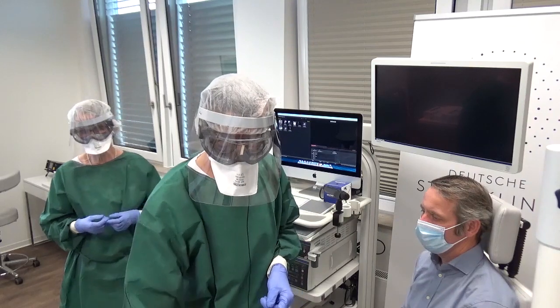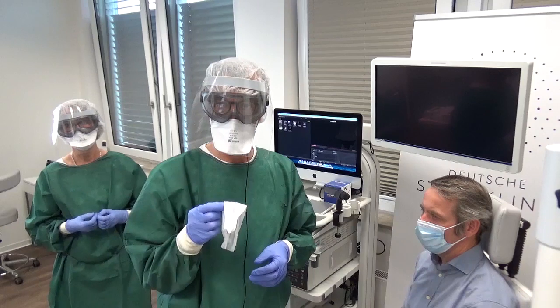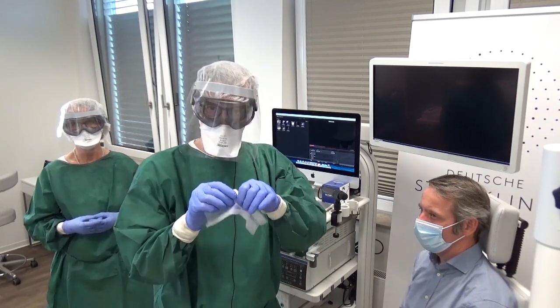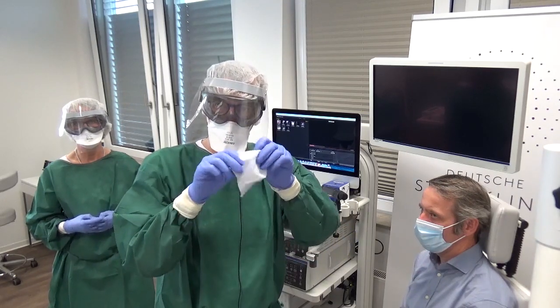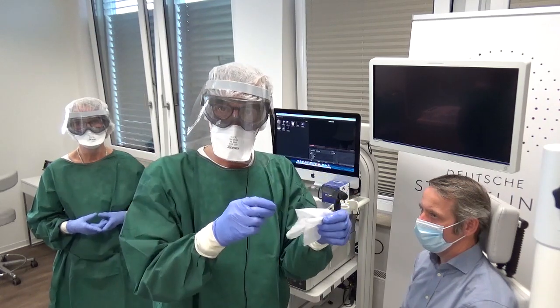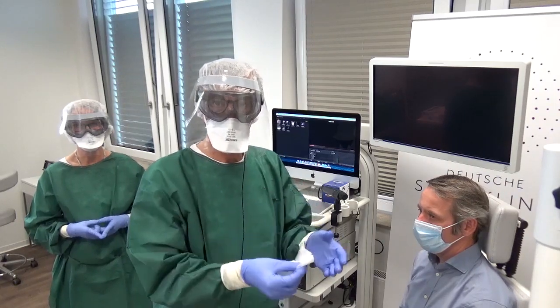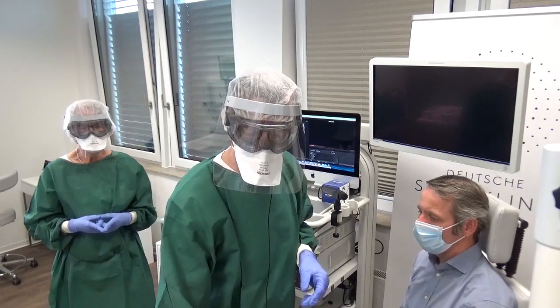We have also prepared — and that's very important — non-alcoholic wipes. There's a special technique for how to wipe off the secretions. Don't ever do that forcefully with the endoscope, but only wipe off the secretions gently so that you decontaminate the gross secretions and infectious material before you hand over the endoscope to your assistant.